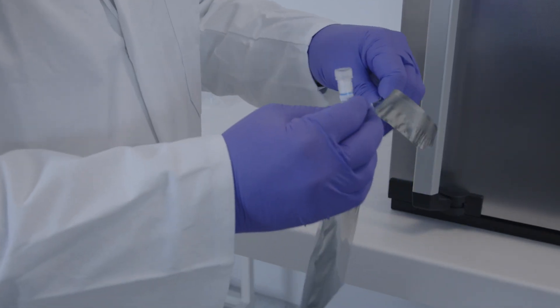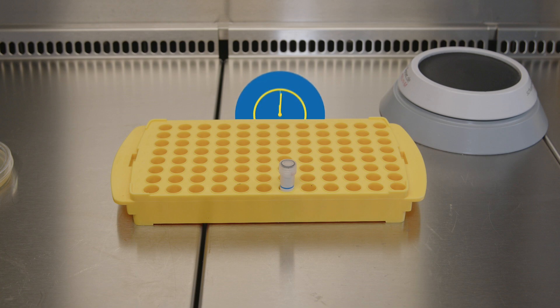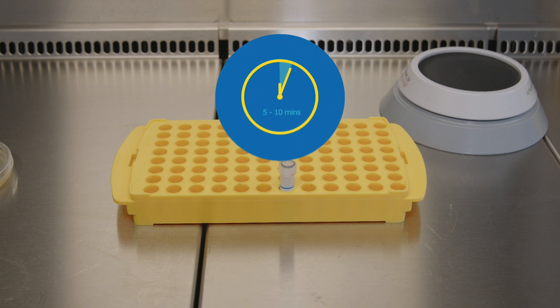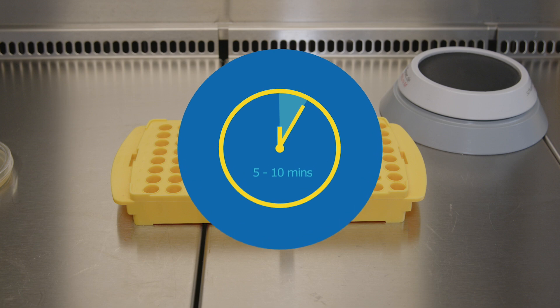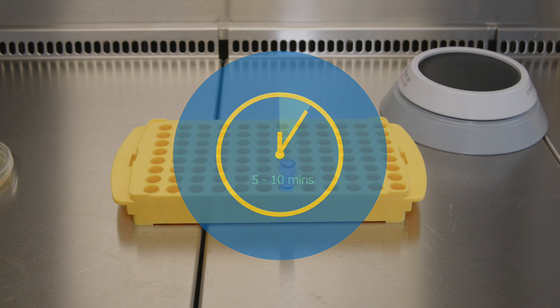Then reseal the bag. Let the vial stand for five to ten minutes to reach ambient temperature. Do not refreeze it. Use the disc within one hour of transfer to ambient temperature.